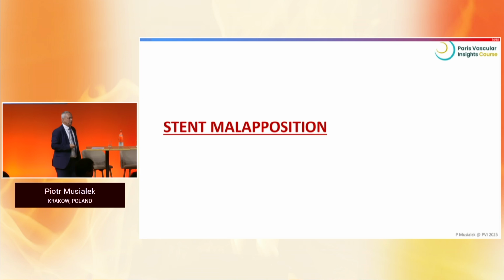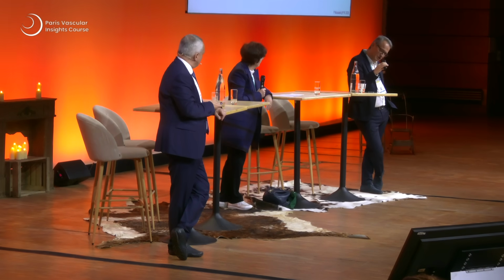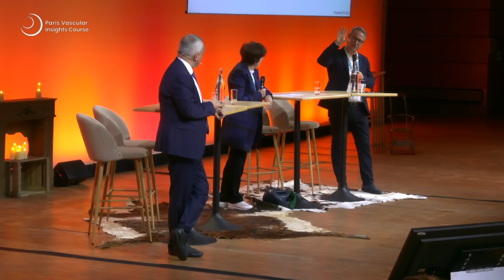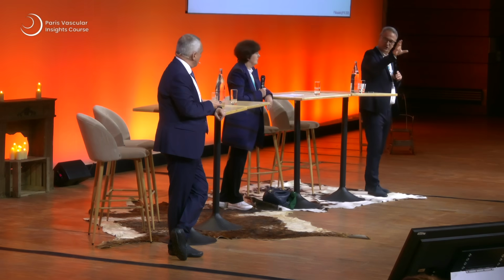What is the problem with stent malapposition? Any problem or no problem? You remember the first slide, Professor Rantner's endarterectomy, removing all the stuff from the vessel, saying, well, you stenters, you'll never get there. This is very interesting, but what does malapposition mean? This is malapposition after stent angioplasty at the bifurcation, into the internal or the common carotid. It is the room between the stent and the wall of the artery and the plaque. There are parts of the plaque that prevent your stent from fully expanding.